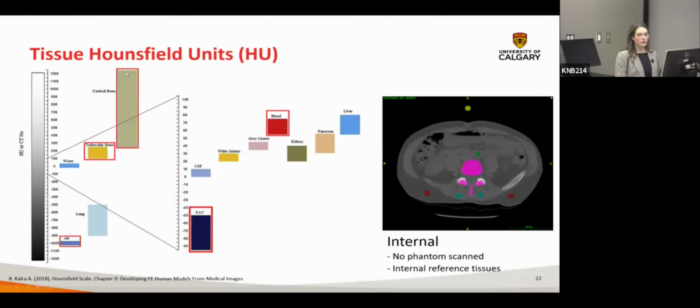Cortical bone has a higher spread, and I'm going to talk about how we overcome this and pick the top Hounsfield units when doing our calibration, because it's the bottom part of the calibration curve at the air and the top for cortical bone that are the most important and are going to sway how that looks. Then somewhere in the middle, we get our adipose tissue and blood, and what's missing from here is our skeletal muscle, but we get those three tissues in the middle.